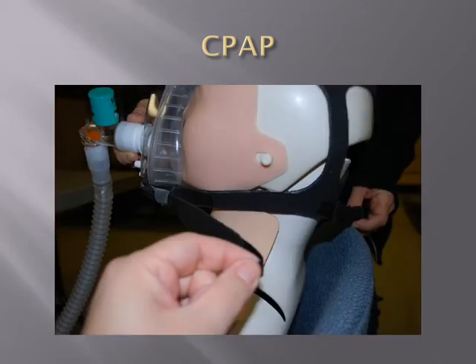And now tighten the straps to make sure that the mask is nice and snug on the patient's face and there are no air leaks around the mask.